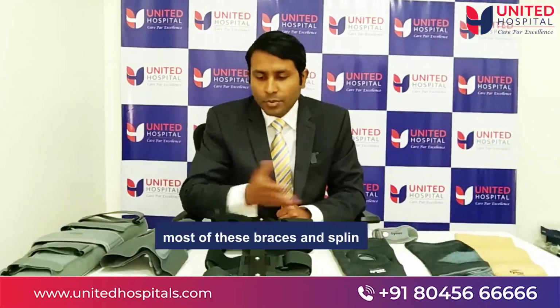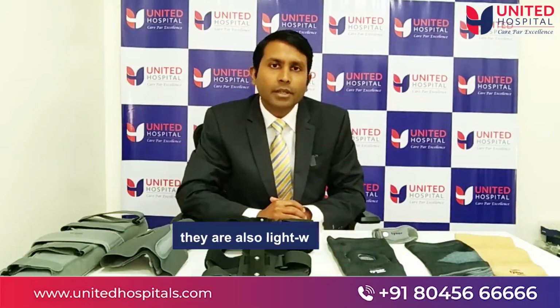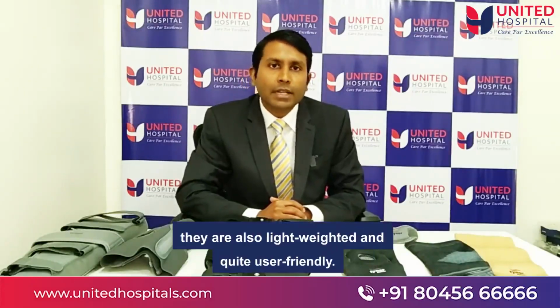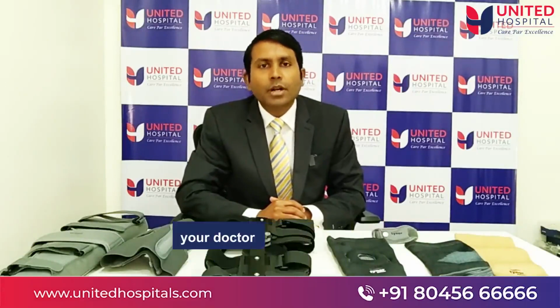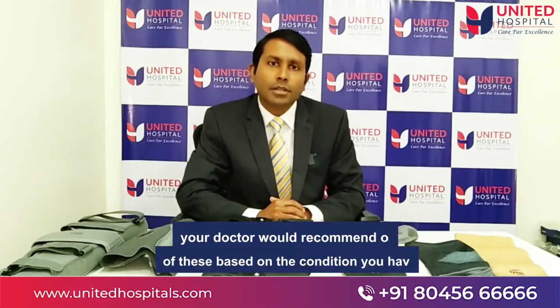So as you can see, most of these braces and splints are manufactured from modern materials including neoprene. They are also lightweight and are quite often user-friendly because you can take these off for hygiene purposes. Your doctor or your surgeon would normally recommend one of these depending on the condition you have, and also would suggest the duration that you need to use them for.